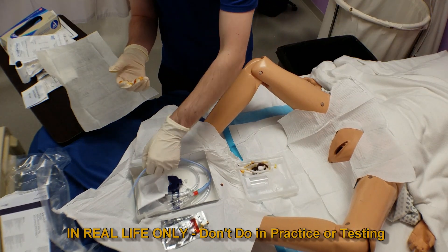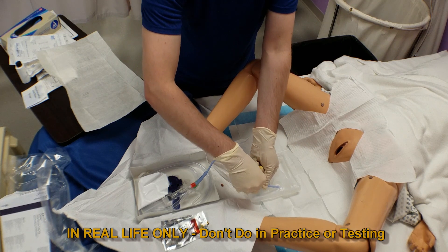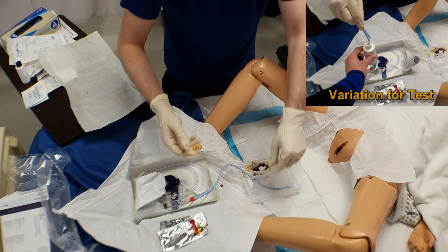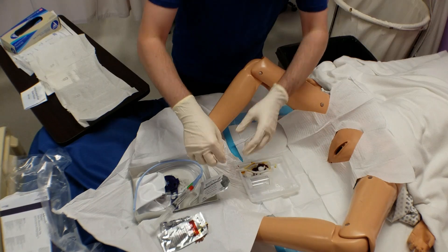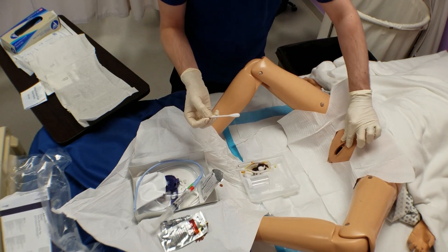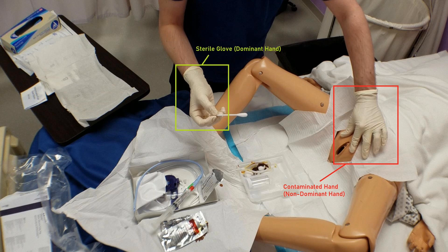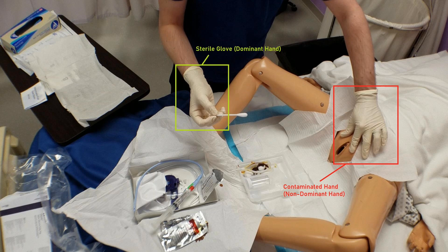Next, lubricate the catheter. In the field, grasp the catheter and run the first few inches through your lube in the tray. For practice and the performance test, avoid using the kit's lube — your evaluator will offer a bottle of mannequin lube, so simply dip your catheter into the bottle instead. Double-check that you have prepared appropriately, then inform your patient that you are going to prep her perineum. Using your non-dominant hand, spread the labia to fully expose the patient's urethra. This action contaminates your non-dominant hand — you may not touch any sterile contents with this hand. Remember that betadine would be used in real life.